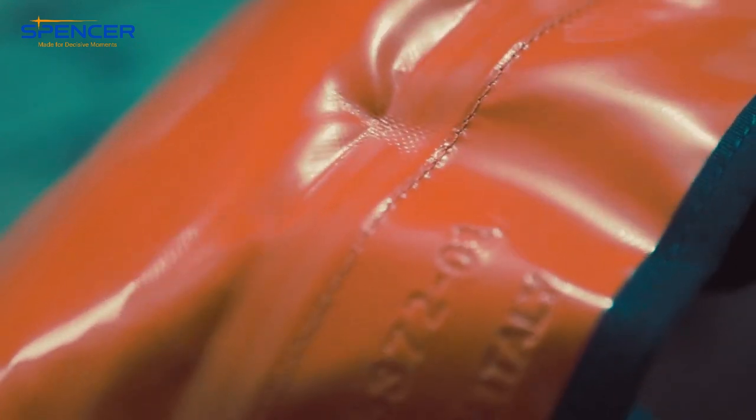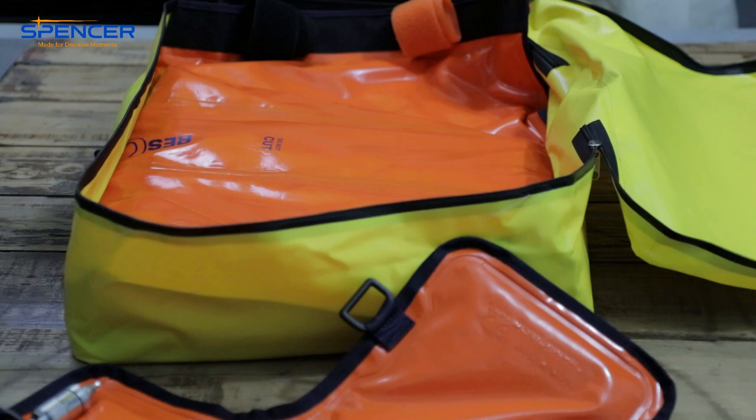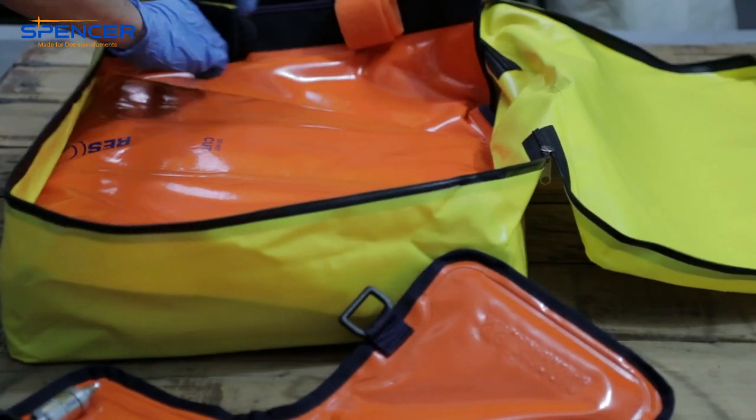This seems like a pretty cool vacuum splint — definitely impressed. I like it. Nice kit.